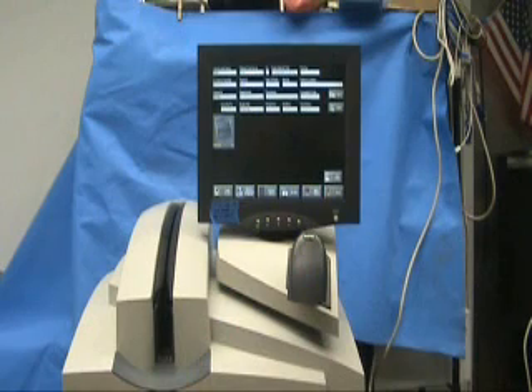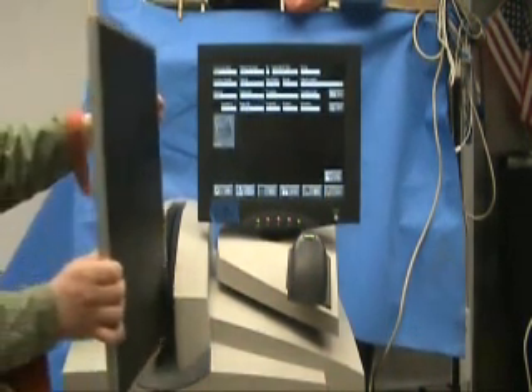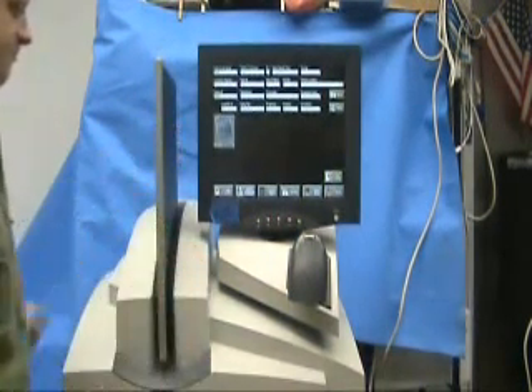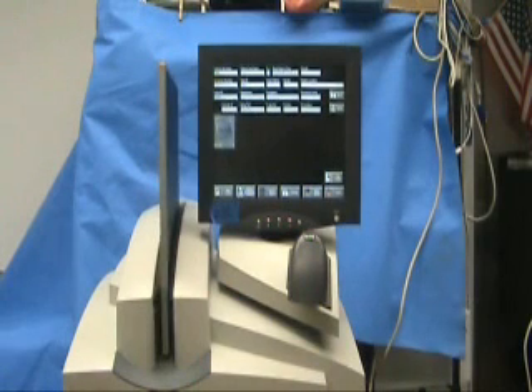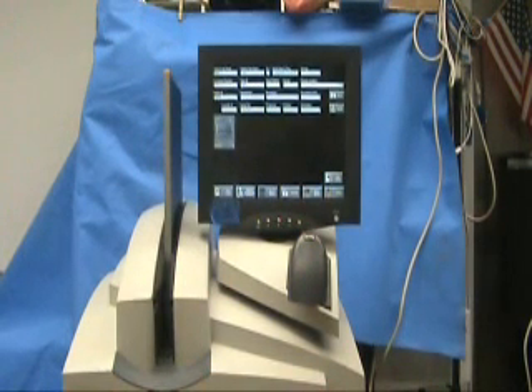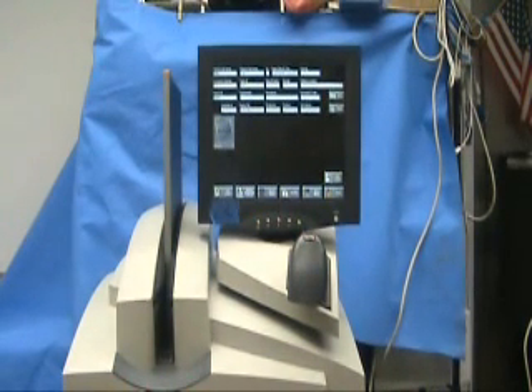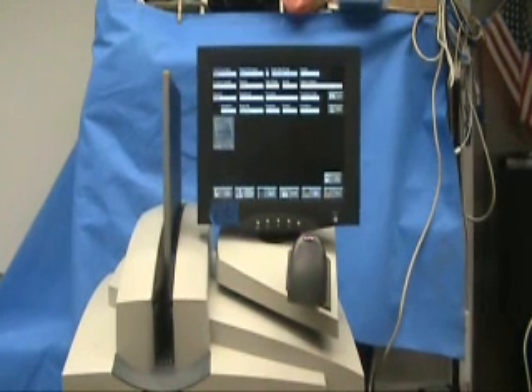Now that we have taken our X-ray, we come back to the CR800 and we simply insert the cassette in the top with the yellow tab up towards you. Push it in until it stops and the machine retrieves it. At this point it is going to pull the cassette plate down and scan it. We will see our image appear and it will also erase the cassette.